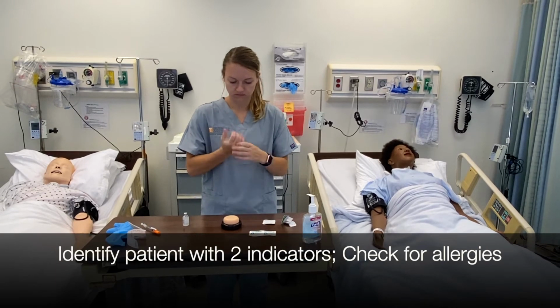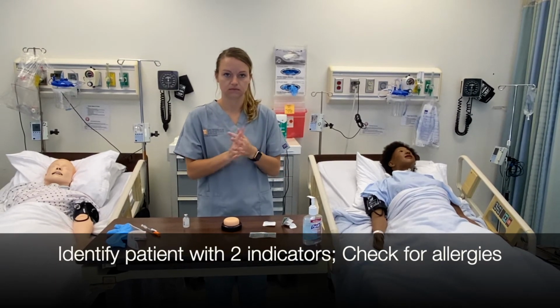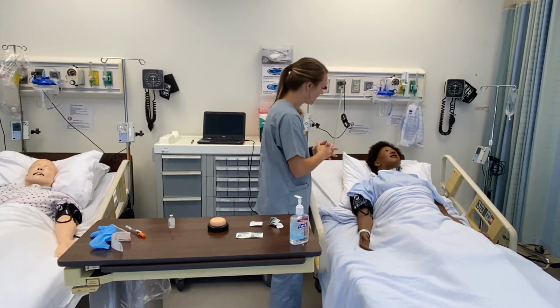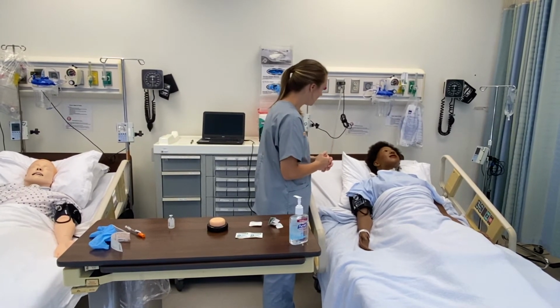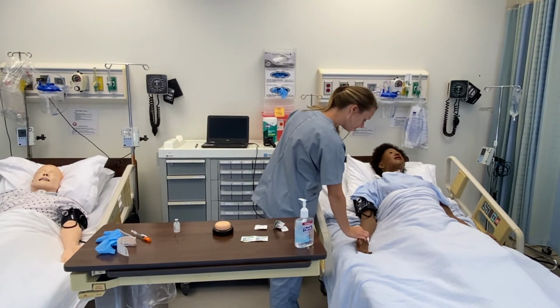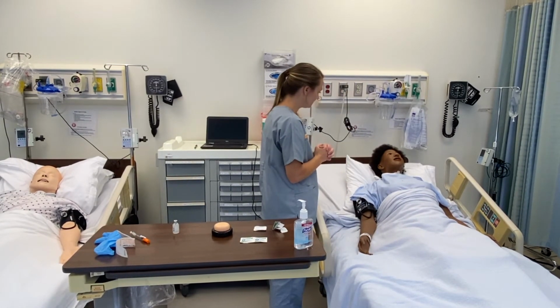Identify patient with 2 indicators, name and date of birth, and check for allergies. Hi, Miss Susan. I am your nurse today, and I'm going to give you your insulin. Can you tell me your name and date of birth? Susan Smith, 7/24/69. Perfect. And do you have any allergies? No allergies.